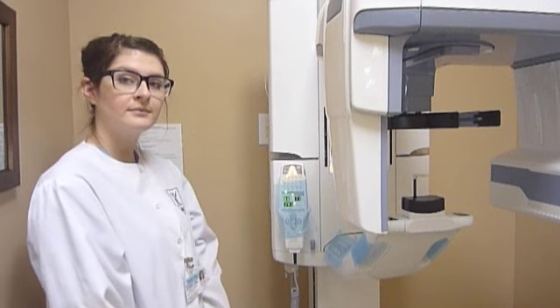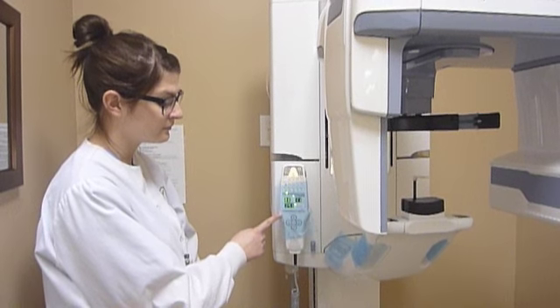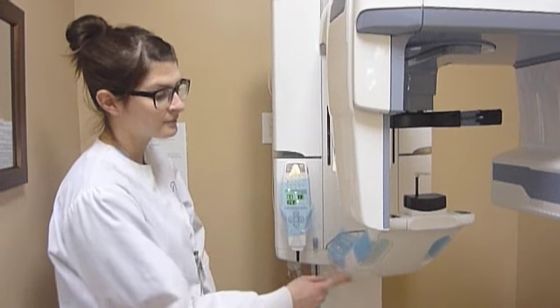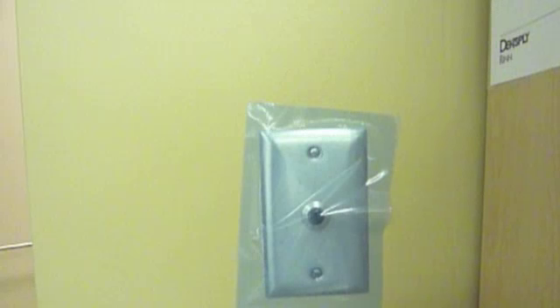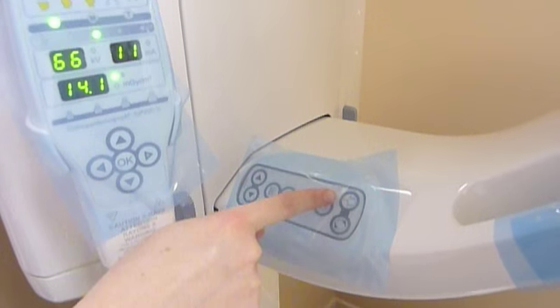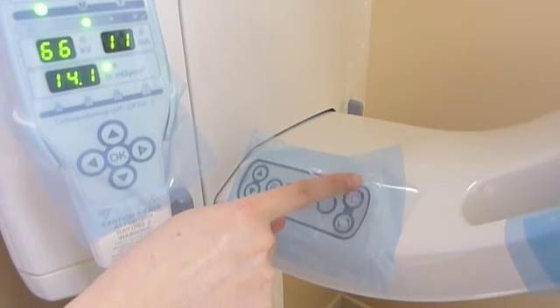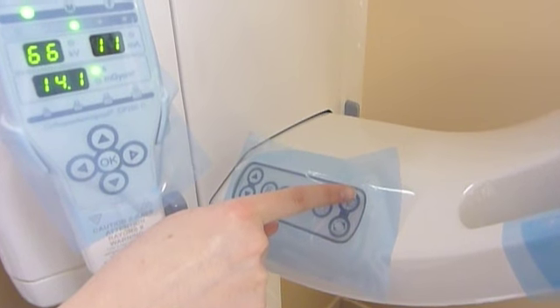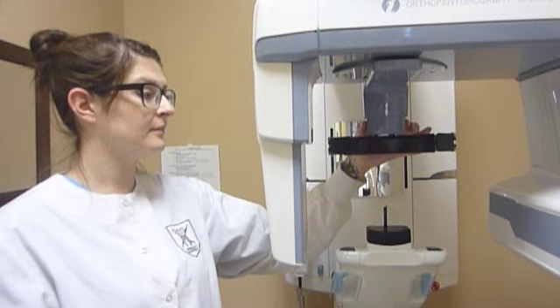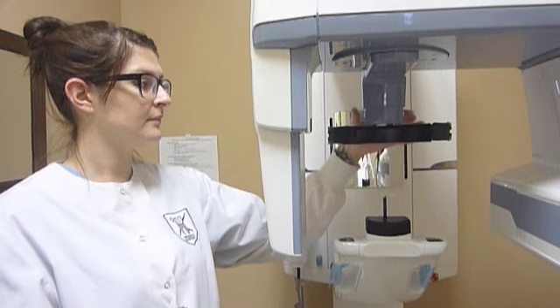5 barriers need to be placed by the dental hygienist. 1 on the control panel, 2 on the patient ready panel, and 1 on each of the handles. The last barrier to place is on the exposure button. After placing the barriers, the dental hygienist must press patient ready prior to the patient entering the room. Make sure that the head support is as far forward as possible and that the temple supports are as wide open as possible.